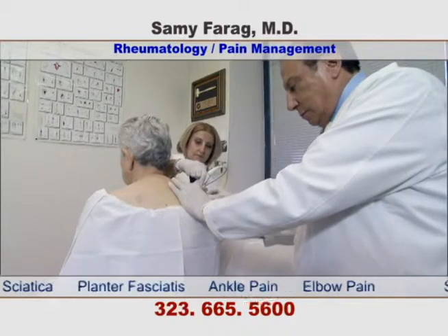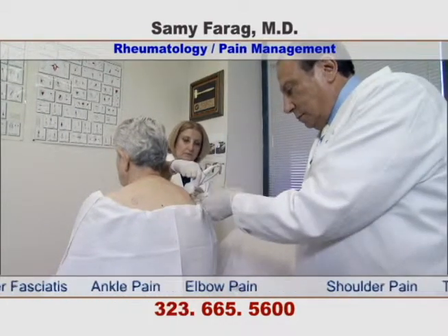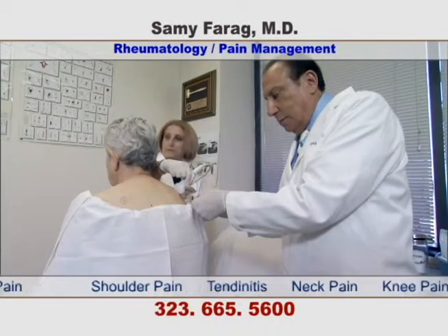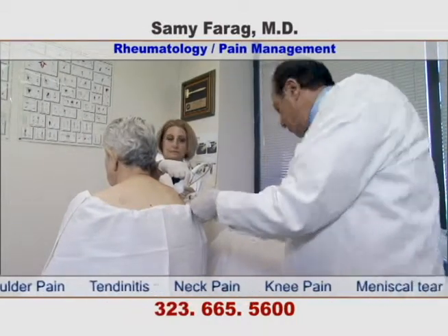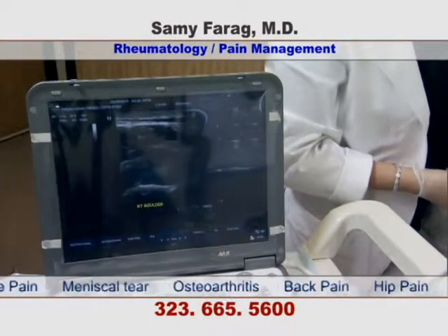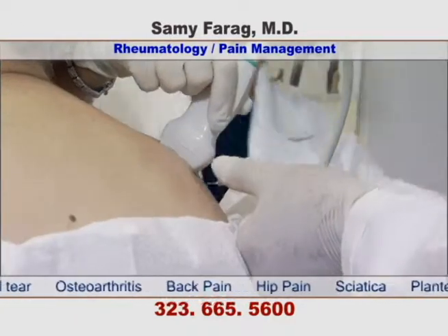Here, the doctor is injecting into a patient with bilateral rotator cuff tendinitis. The doctor is checking under ultrasound guidance and will inject the PRP into the damaged area.